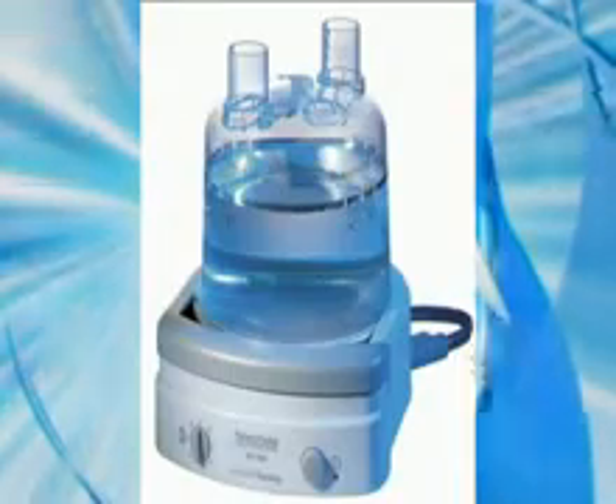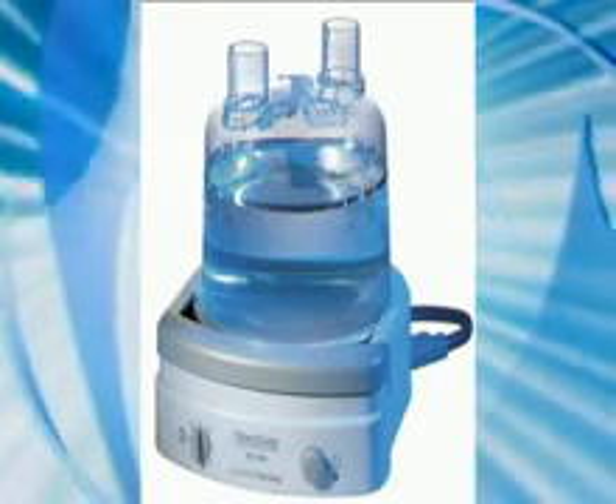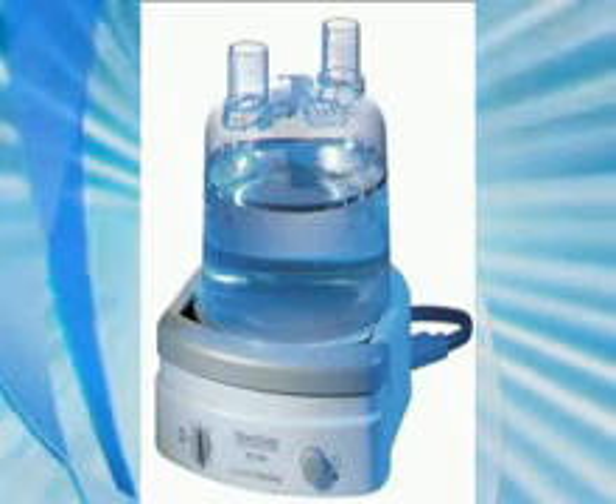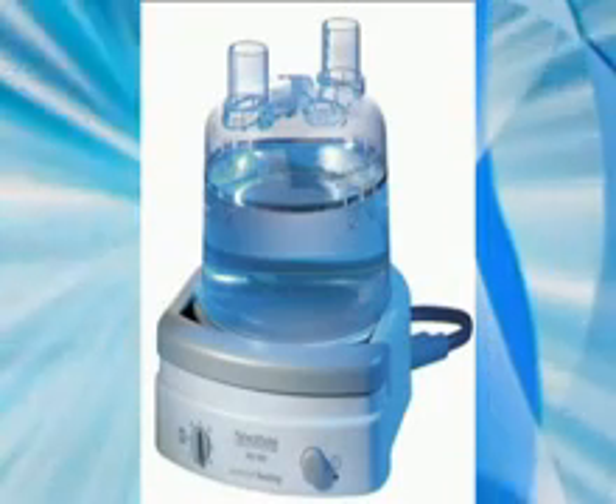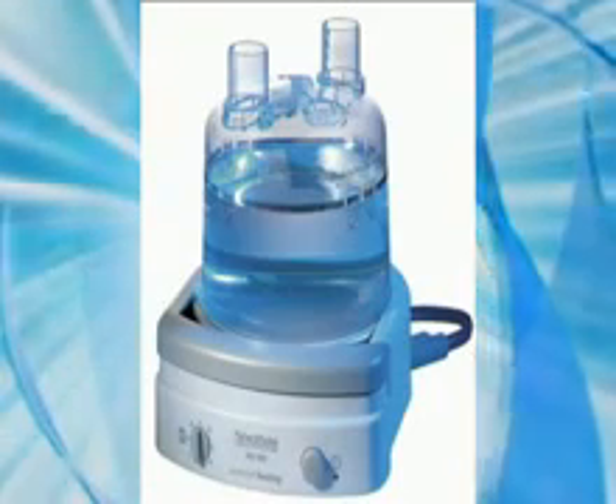You've also been loaned a Fisher & Paykel HC-150 heated humidifier to be used with your ventilator. This will provide you with warm, moist air, which is important for your airways.